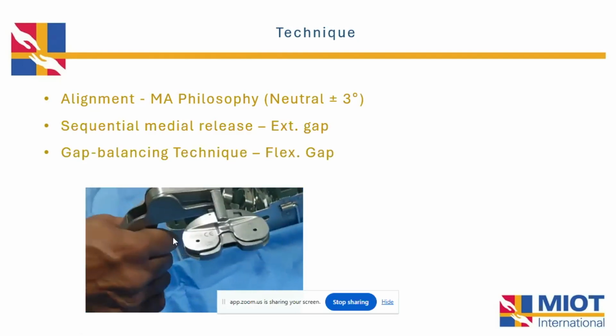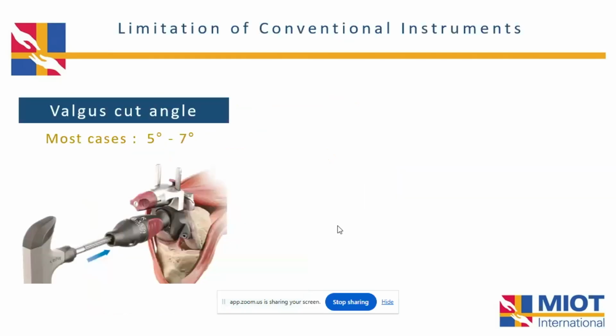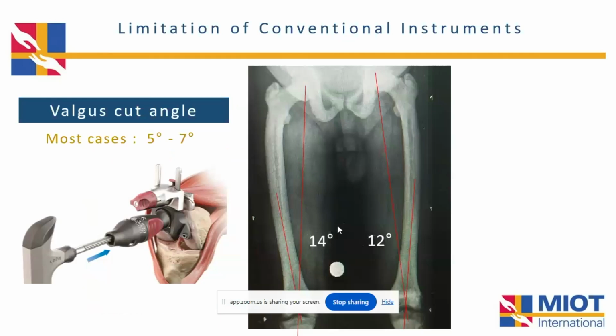Once the gaps were measured, by using this 3D virtual balancing, we managed to position the femur such that the gaps are balanced. Basically, it's a gap balancing technique. Now, another interesting factor here is, in the scanogram, we showed that the proximal femur is bowed.